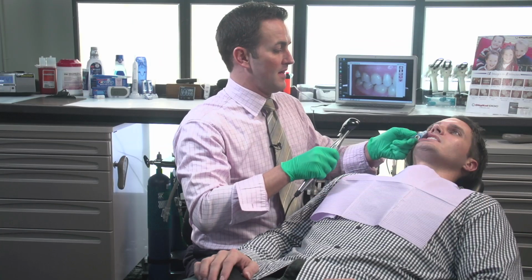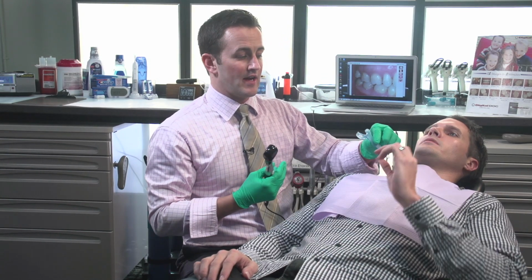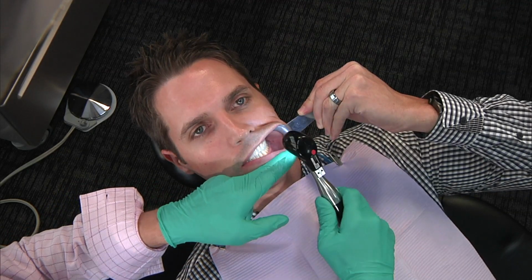Perfect. Now to keep you guys on time, instead of rushing off to the other side and switching hands, we're going to have the patient retract themselves on the other side. Now you're going to see a constant theme here because I've had my hands on that labiomental groove for the first 3 shots. We're going to go ahead and actually reduce those to 2 fingers, still positioned.